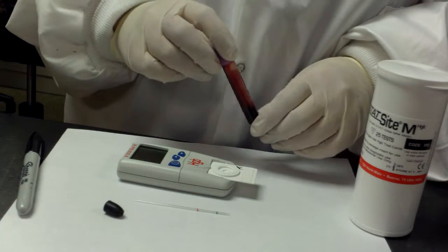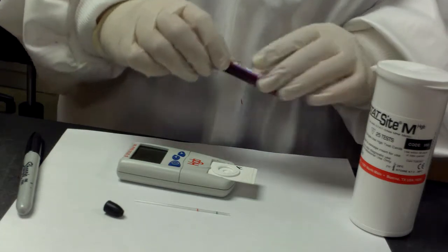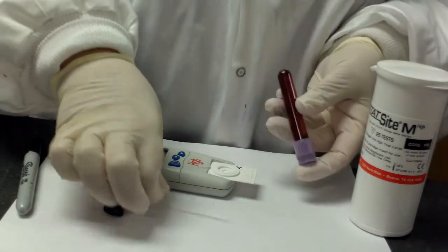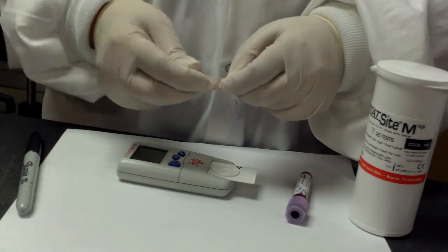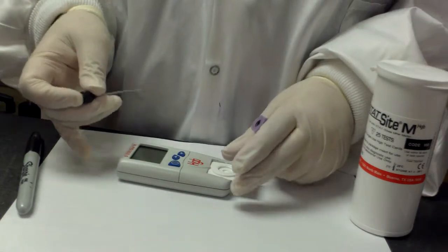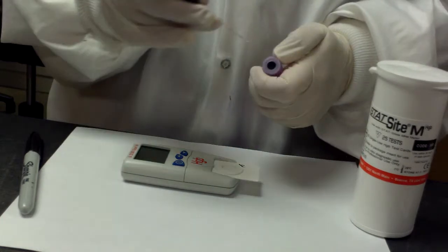When we're using a tube of blood, which we're going to do today because I'm tired of sticking my finger, you want to make sure that you mix this very well. You can use a fine tip transfer pipette. You don't want to use a standard one, because it gets too much. Or you can use a little capillary tube with the little bulb on it. And all you have to do, it tells you, put drop on slide.